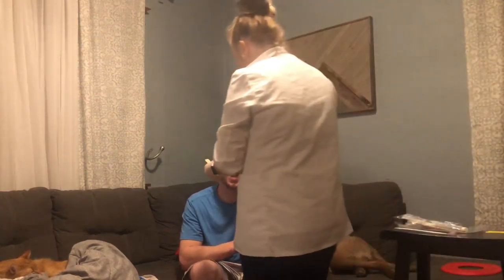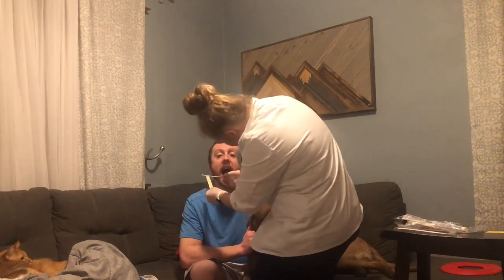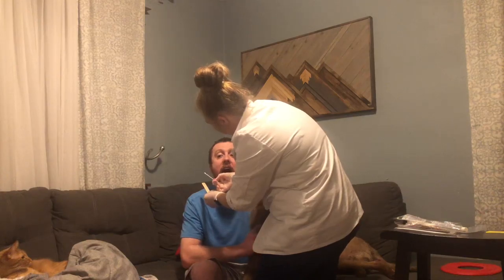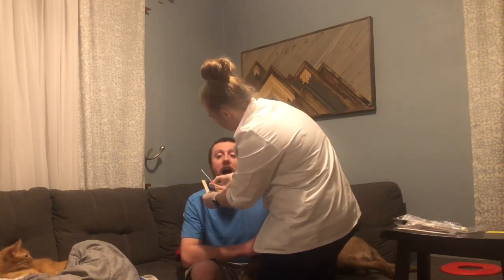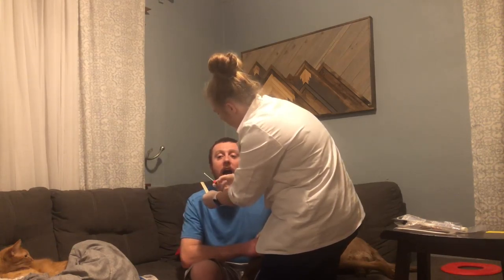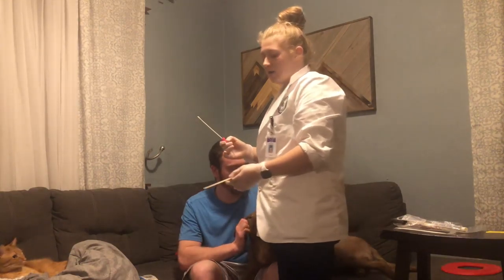I am then going to grab a tongue depressor and gently place it on my patient's tongue. Looking at the uvula, I will insert the swab, avoiding touching the uvula. I will then swab the posterior pharynx, which is the tonsillar area. If there's any white exudate, I'll make sure to swab that as well. I will then slowly and gently pull the swab out, making sure not to touch my patient's tongue, teeth, or uvula.